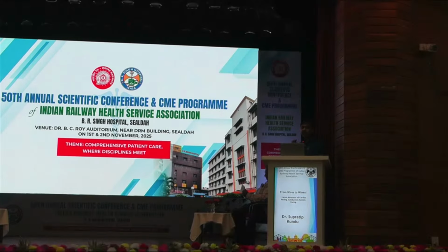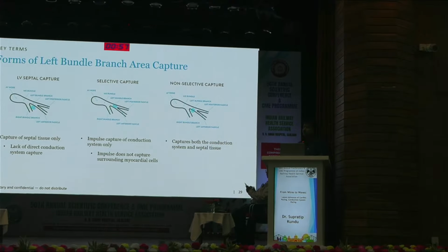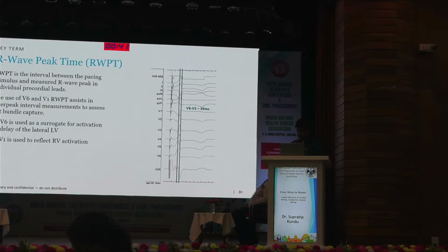And this is the idea of selective capture, non-selective capture, and LV septal capture. In LV septal capture, only the myocardial capture is important. In non-selective capture, both myocardial and conduction system are captured, and in selective capture, only the conduction system is captured.